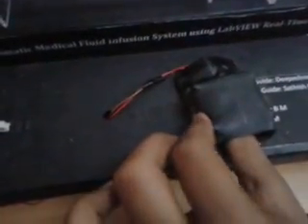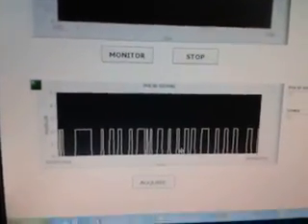Here it is used to acquire the pulse rate. So this works on the plethysmographic method. A patient's finger is placed on the sensor inside this. We get a pulse signal as shown in the graph, and finally this indicates the pulse rate of the patient.